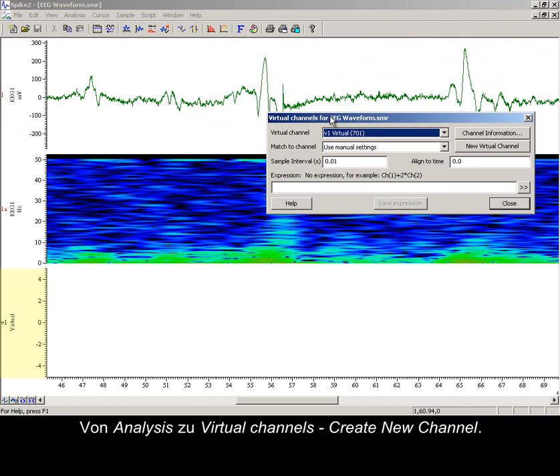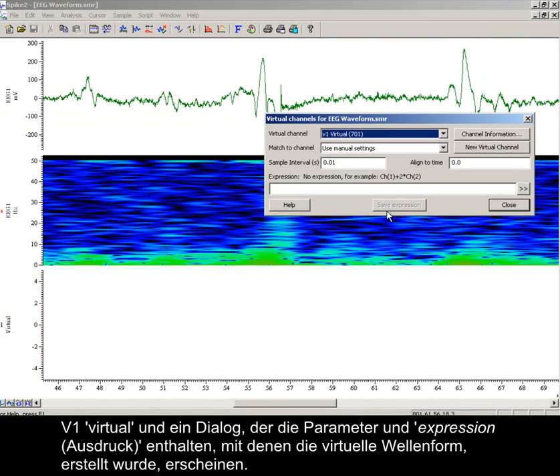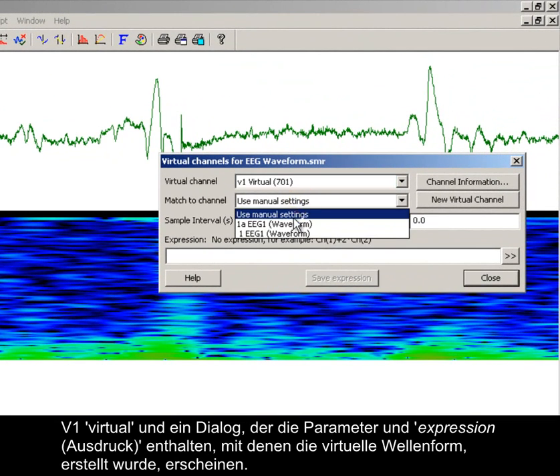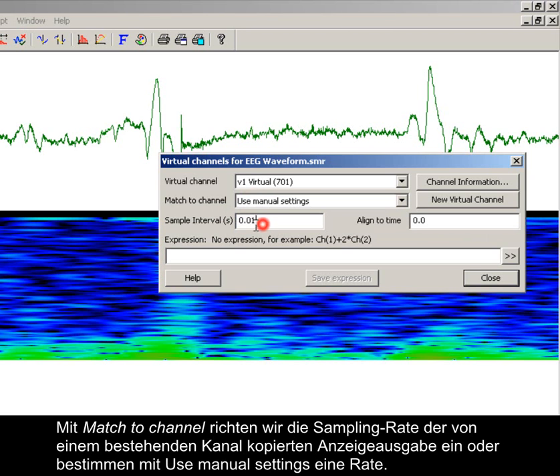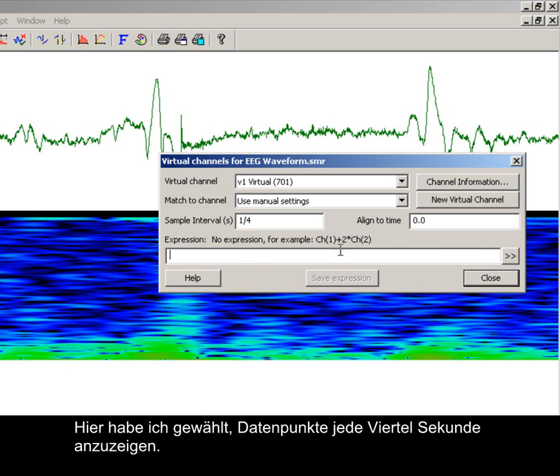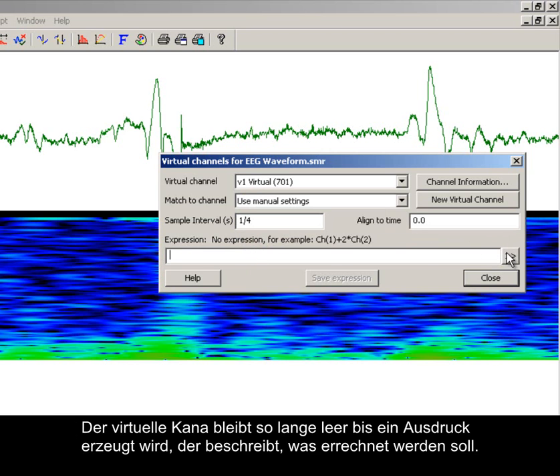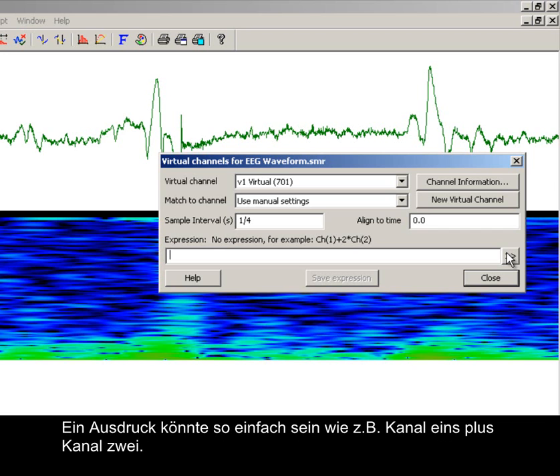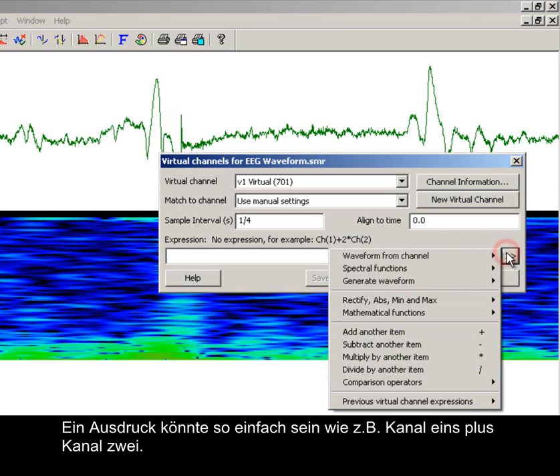From Analysis, go to Virtual Channels and create a new channel. V1 virtual appears and a dialog containing the parameters and expression used to create the virtual waveform opens. With match to channel, we can set the sample rate for the output based on an existing channel, or use manual settings to define a rate. Here I have chosen 4 Hz as the output. The virtual channel is empty until an expression describing what is to be calculated is produced.